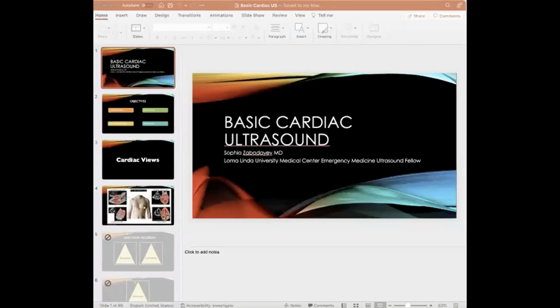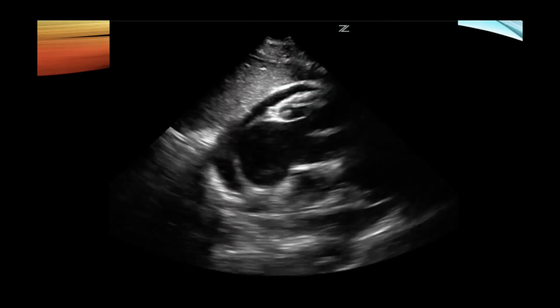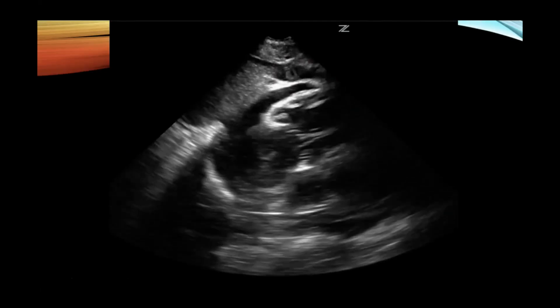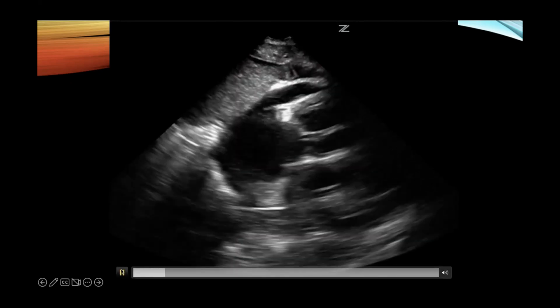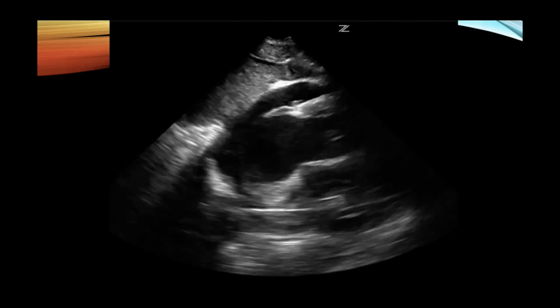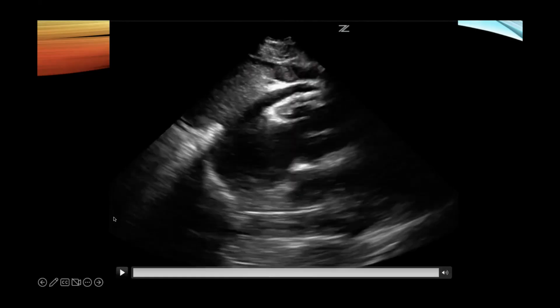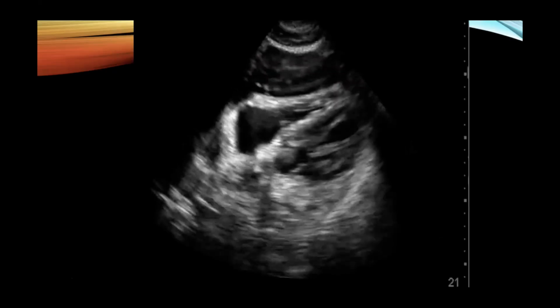You can kind of see it by the liver. Do you see it? That's interesting. Yeah, I had thought that just because it's sort of linear in nature, and I thought it was compressing, so it looked like a vein to me. But now I can see, especially it enlarges in a weird way as it goes around that hepatic, I guess what's called a corner there. It looks like it, but it changes. So I see. Yeah, it just goes to show I got to look a little harder. That's why we always get lots of views in ultrasound, right? Because they love to trick us.